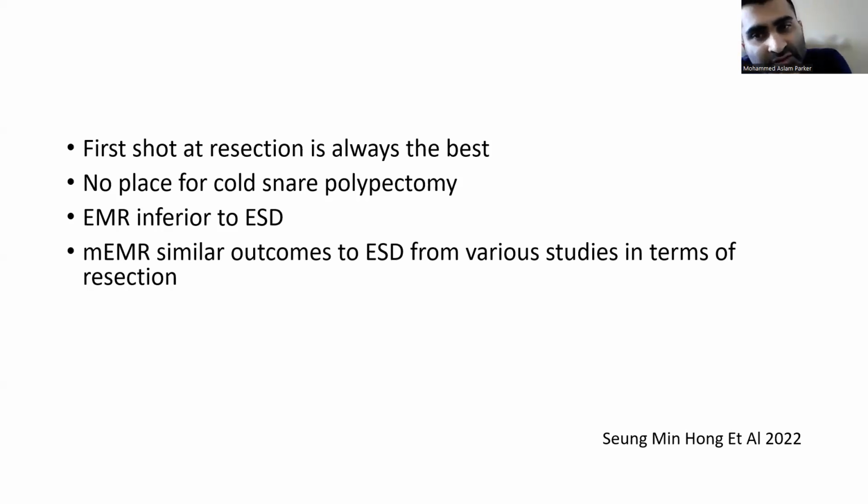It's not as easy to go back and get the lesion out when it's fibrosed. So a patient may end up over-treated with surgery, or when someone does a biopsy, you end up with the same outcome. So first shot at resection is always really the best.